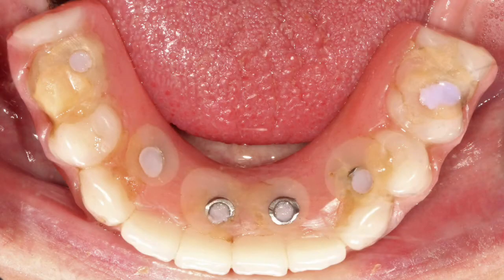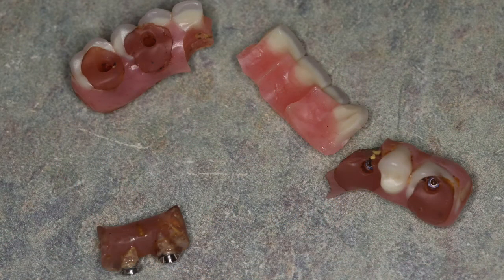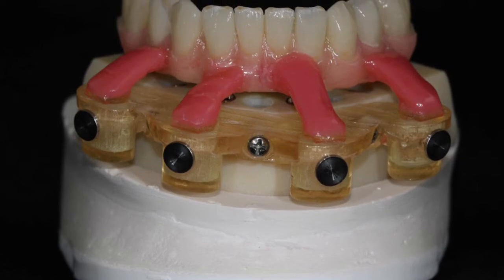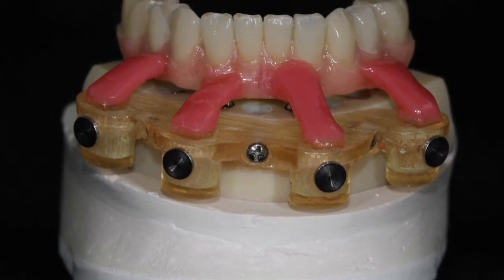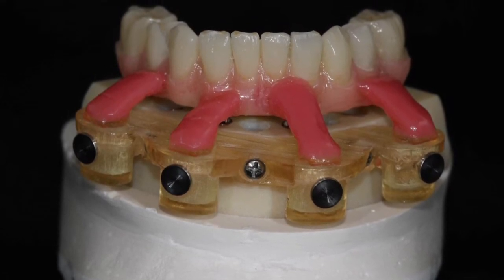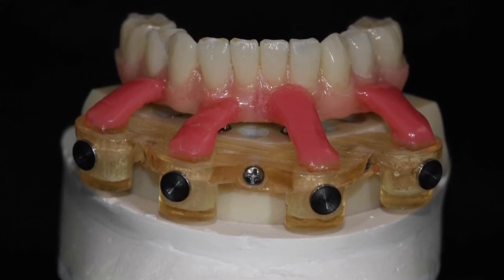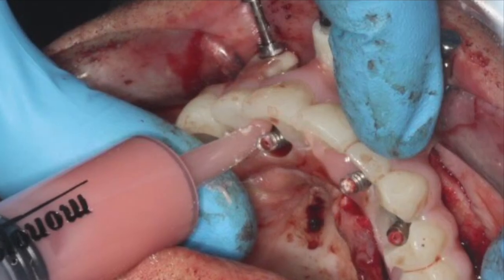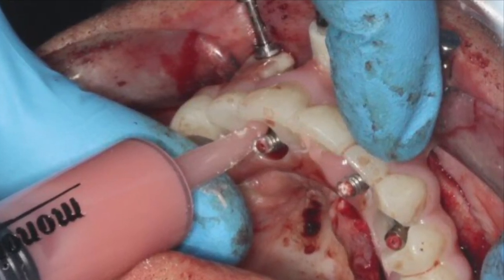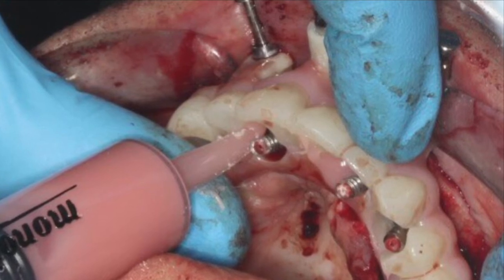So you end up with something that doesn't resemble the final restoration, and two to three months later they typically come in like this on a Thursday afternoon wanting something to be repaired. One solution is these very expensive guided prosthetic approaches, but the occlusal anatomy and occlusion isn't much better than the original. Plus there are times when you put all this money, energy, effort, and time into these guided prosthetics but the implants aren't ready to load.